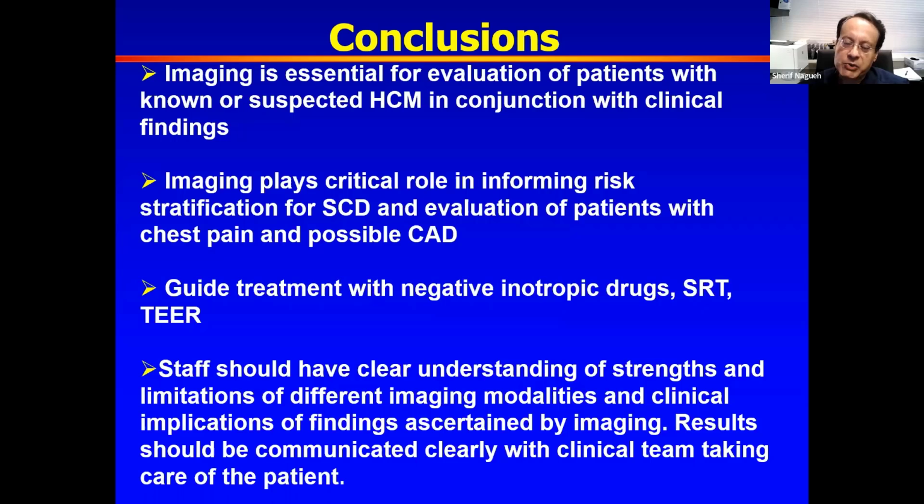Certainly, if you have a patient who's not doing well, for whatever reason, you don't have to wait for a month before you scan them. You look at them sooner. I would emphasize here, you need to be careful with the image acquisition, and you need to be careful with the measurements of ejection fraction, and do not just go by visual estimation, because there can be changes that the eye doesn't catch.